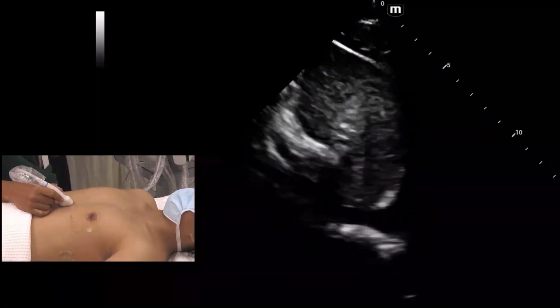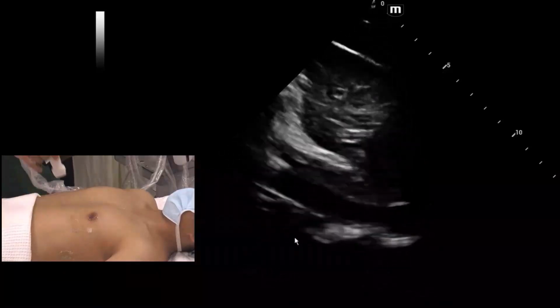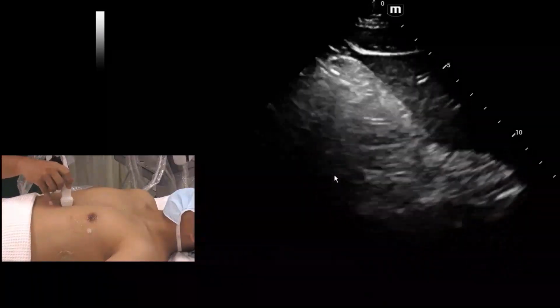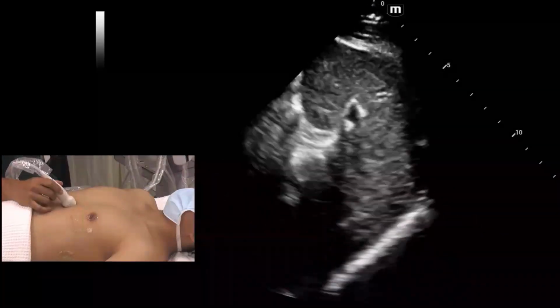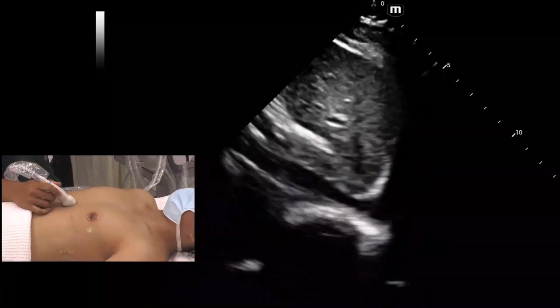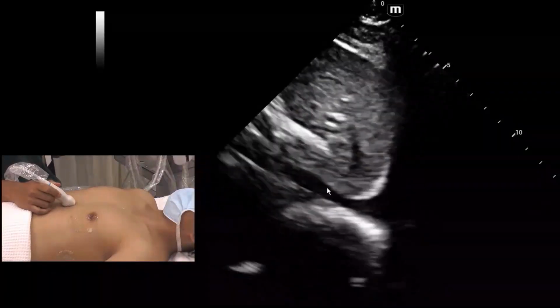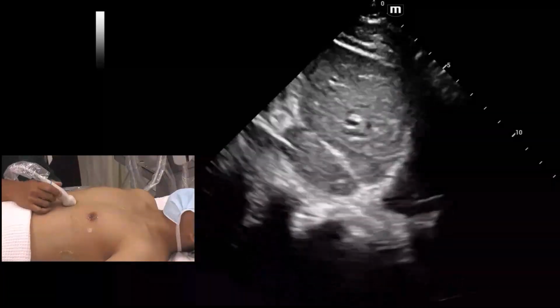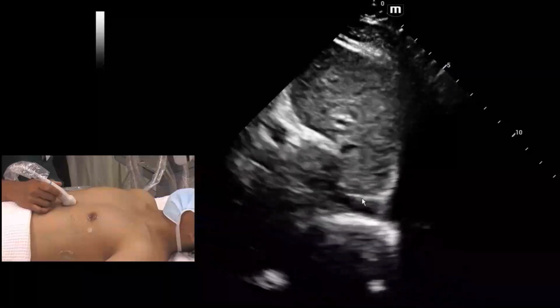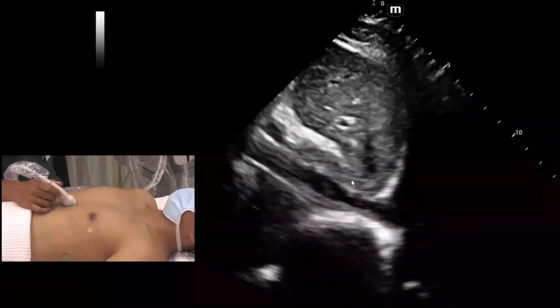The most important thing is to determine whether what you saw in this image is really the IVC, because if I tilt to the right, I can see the aorta. You see that? There's the aorta, there's the IVC, right? So measurement of the IVC must be done dynamically. The reason you can't do it statically is that you get only one point at one time. If you can see clearly, there is the right hepatic vein.